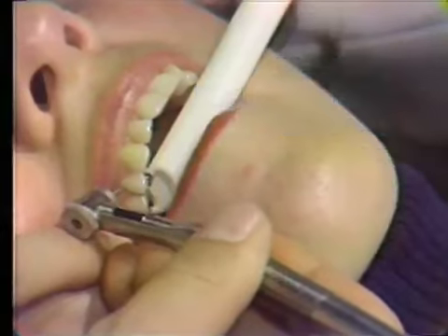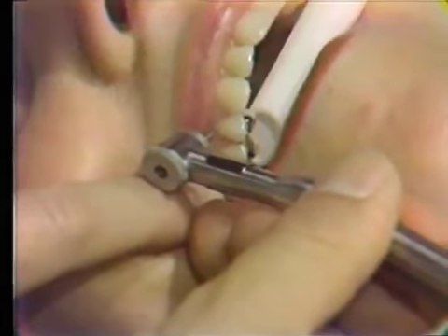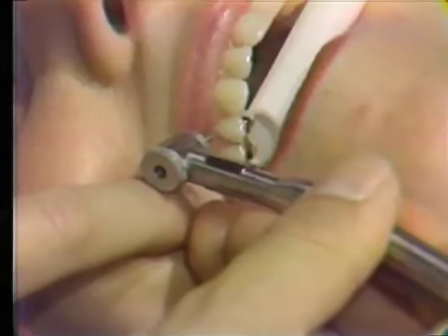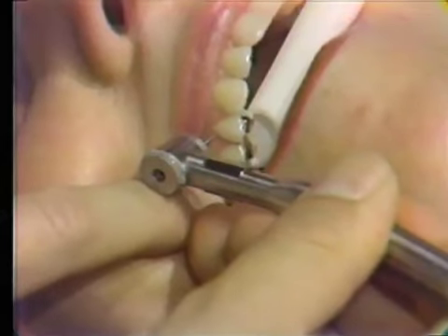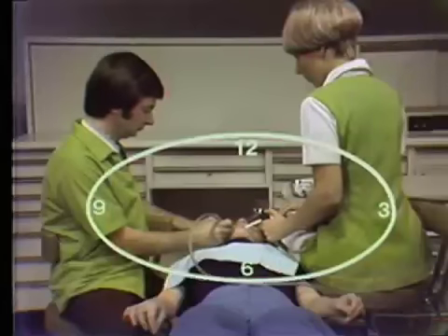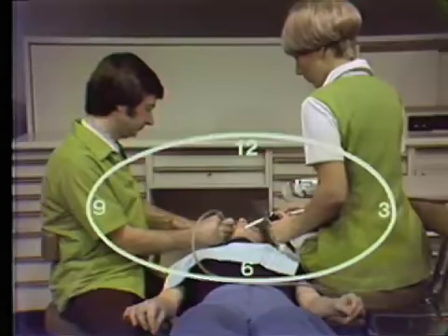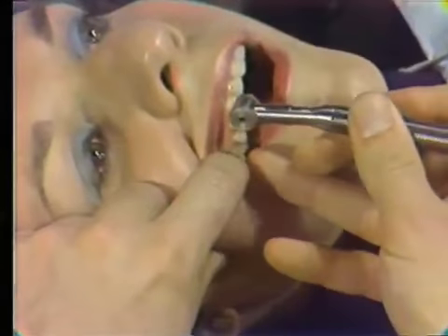Like the maxillary anterior segment, access is excellent for the more anterior teeth in the maxillary right posterior segment when a buccal approach is used. Direct vision is possible while treating teeth in this segment using a buccal approach. With the patient supine, the operator can obtain convenient access from the 9 o'clock position. Final adjustment in establishing access can be accomplished by having the patient turn slightly toward the dental assistant. The operator's left index finger is used to retract the patient's cheek. A stable finger rest can then be established on the left index finger.